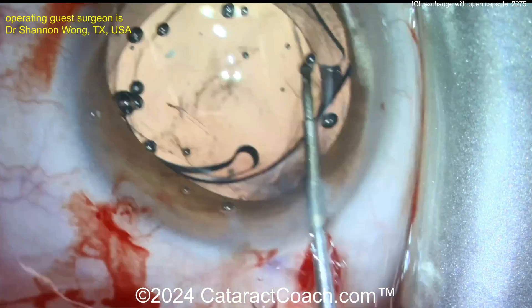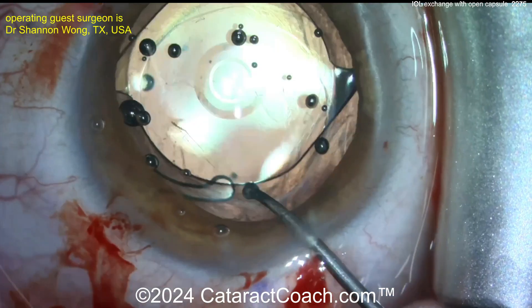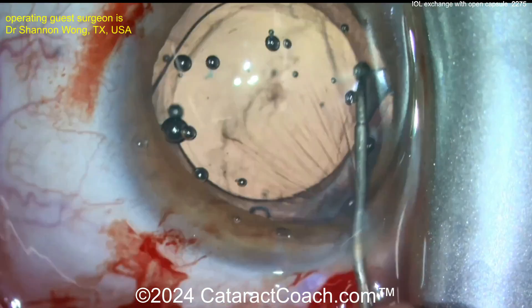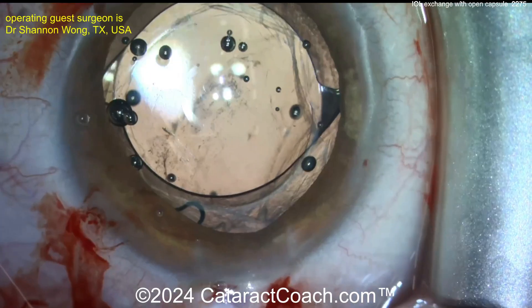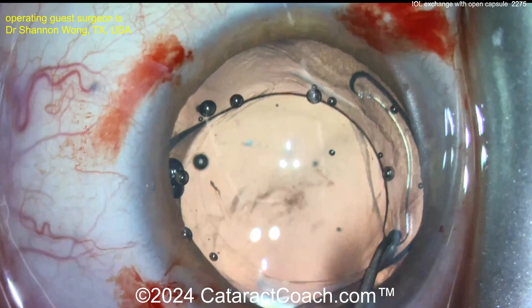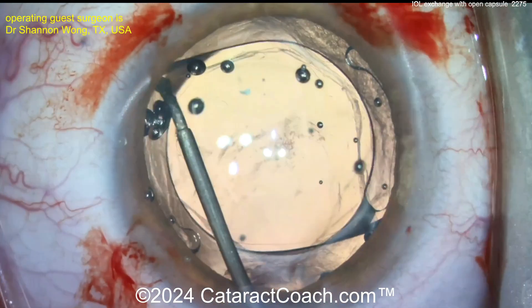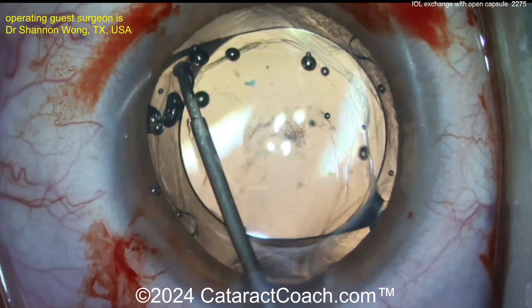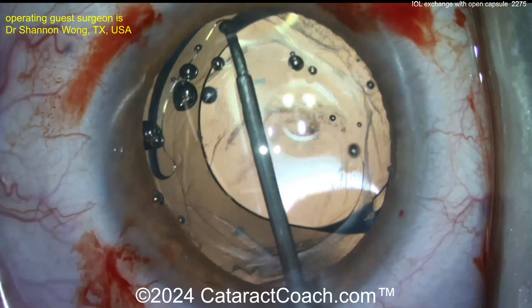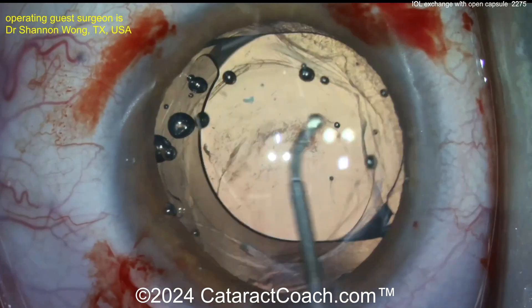Do you exchange one multifocal lens for another? Or do you exchange a multifocal for an EDOF lens, or a multifocal for a monofocal lens? These are all considerations you have to take into account. This is not an easy procedure.